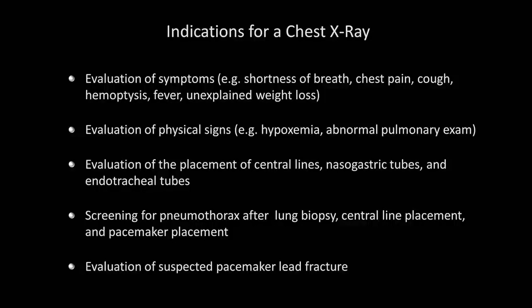For example, routine chest X-rays prior to surgery in the overwhelming majority of patients are of no benefit and should be avoided. Also inappropriate are routine screening chest X-rays for lung cancer in smokers, although there may be benefit in screening chest CT scans, but that's a discussion for another day.